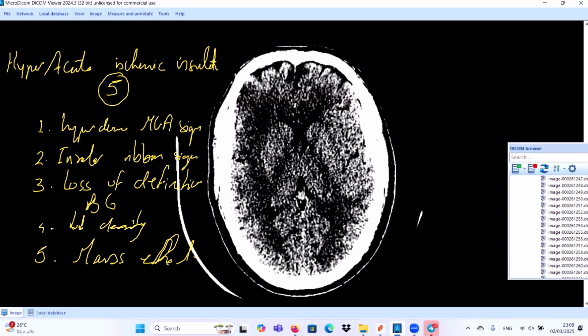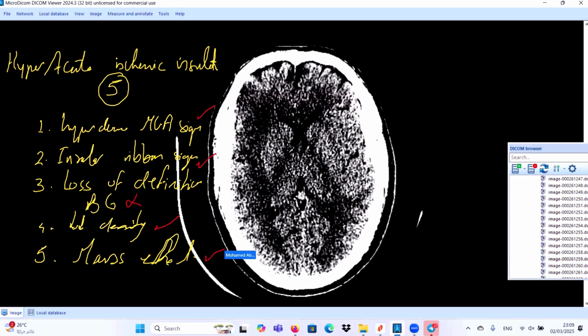We have here in our case hyperdense MCA sign present, insular ribbon sign present, loss of definition of basal ganglia not present, low density yes it's present, mass effect yes. We have low density explained by cytotoxic edema in acute cerebral infarction. Mass effect: sometimes you should be careful of this point because mass effect sometimes is very severe.